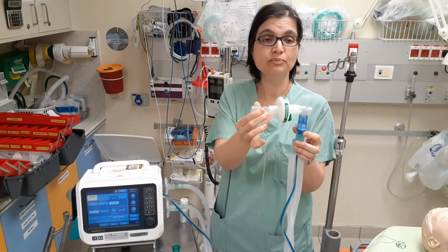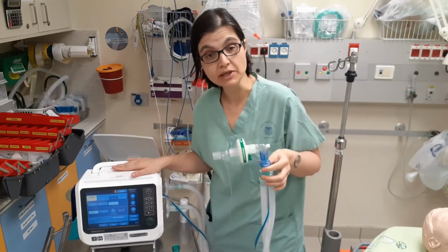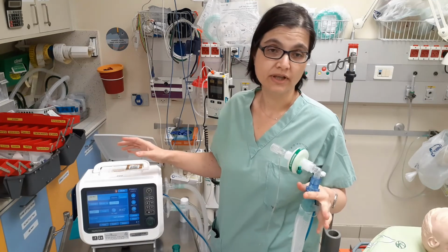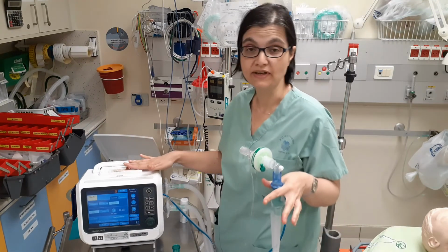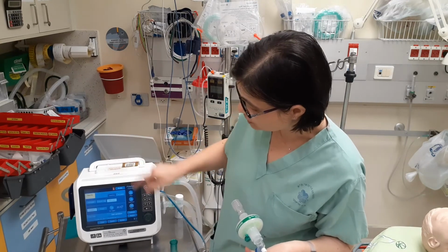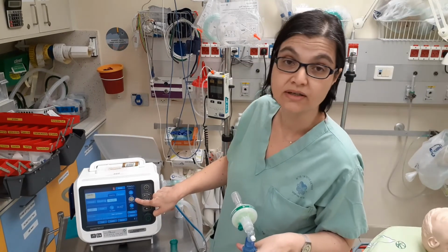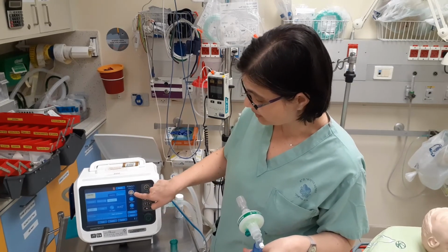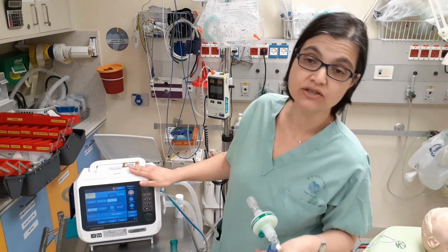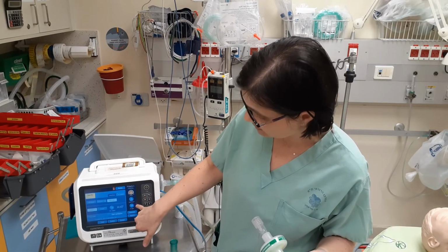After the filter, you can put on your CO2 sensor. When coming to ventilate the patient, it's preferable in the adult literature to work with volume ventilation. However, the majority of pediatric ventilators work and open immediately on pressure ventilation. So when you open on pressure ventilation, make sure please that the PEEP, the positive end-expiratory pressure, will be set at least on 10, and the positive inspiratory pressure will be set at least on 25. These patients require high pressures in order to oxygenate. Of course, 100% oxygen.